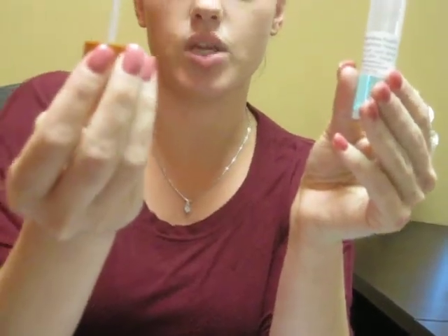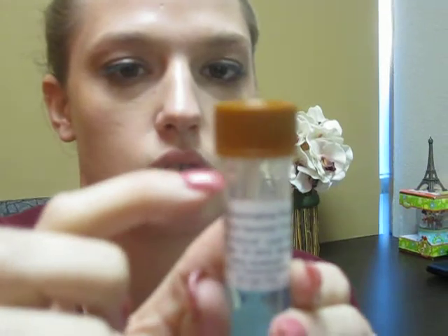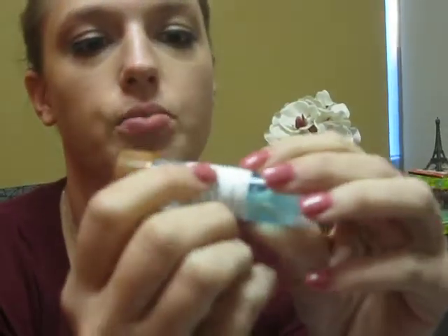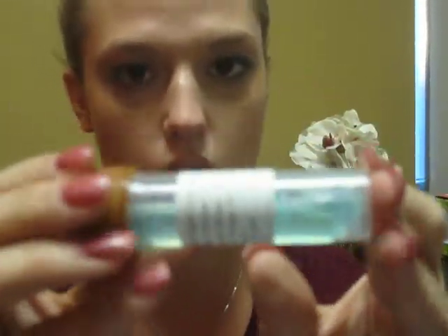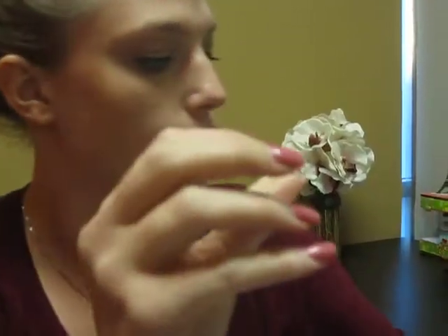So what you're going to do is open it. There is a little plastic spoon that you're going to use to take your stool sample, and you're going to put in as much until that water is almost to the top. So probably this much stool in there, so they have a good amount of stool for you. Make sure you write down the date that you did it on all your samples also. There's a little date and patient's name. Put your name in there also for these 3.